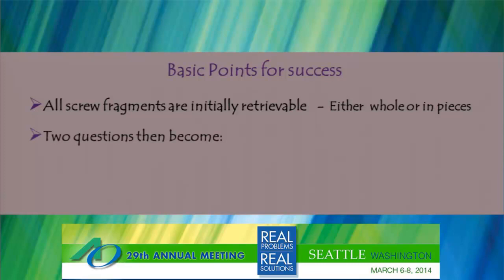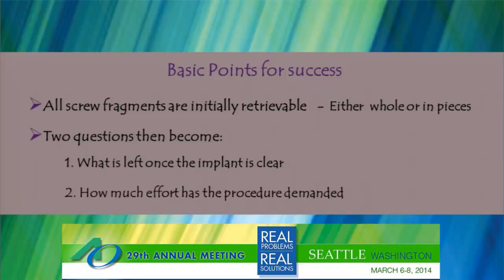The two questions then remain if you've taken one out, because a lot of times as specialists we see one where someone's already tried to work on it. So the question is, what is left in the implant, as in Robert's case, to work with? Is there iatrogenic damage, so you have to make that decision? Question 2 is, how much effort is it going to take to actually save it, and is it worth saving? On an individual case-by-case basis, you have to decide that, and whether the skill sets are available to actually render the save.